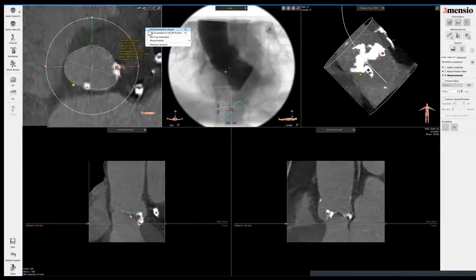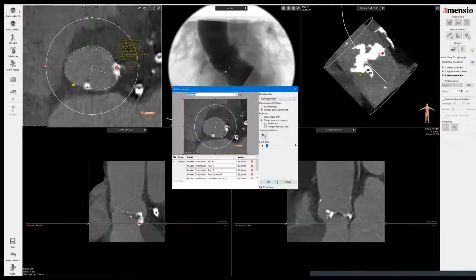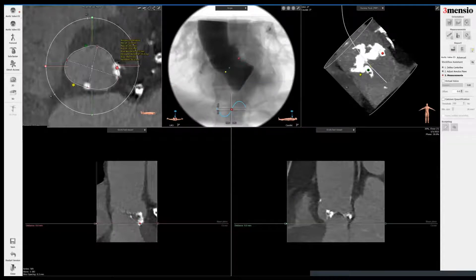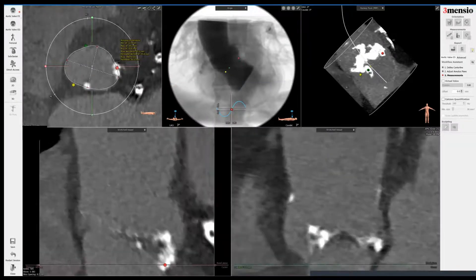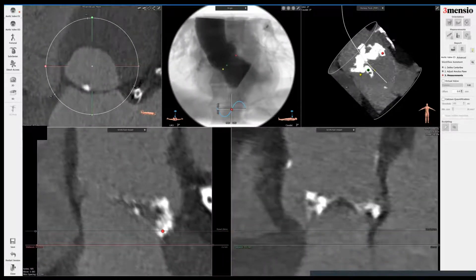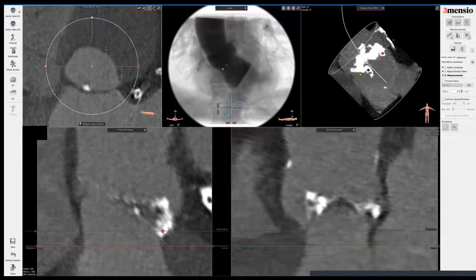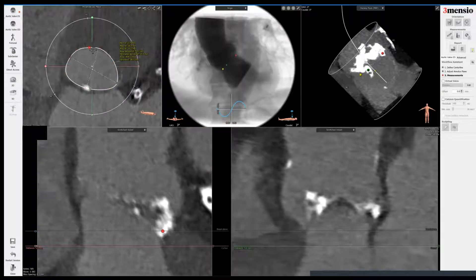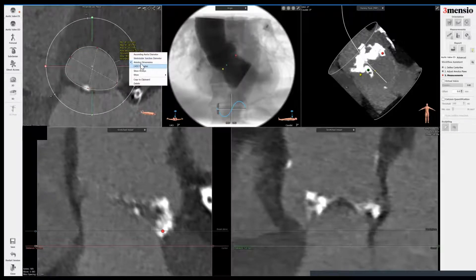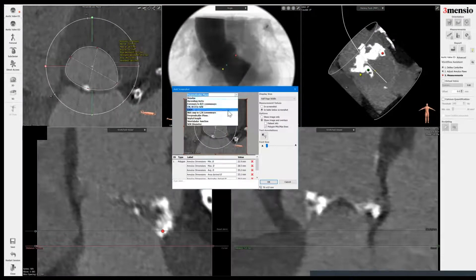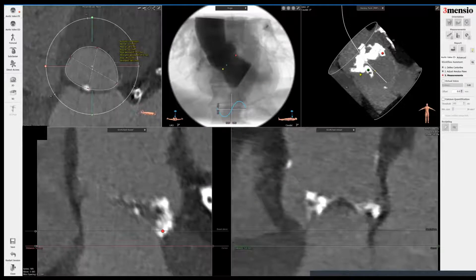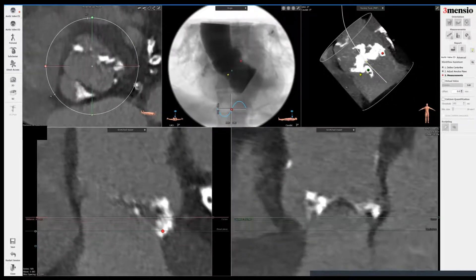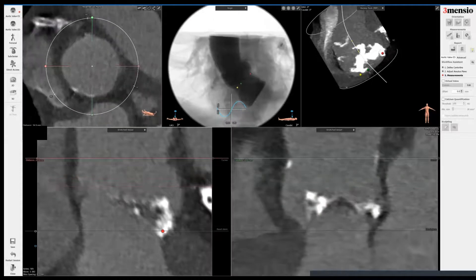Click on the annular dimension and save those images. I crop that, zoom to get a maximum view, and go into the LVOT view. You can see there's still LVOT calcium there. You can see how I cut across the annulus and adjusted the LVOT a little bit. I do it at a five millimeter depth — that's my personal preference because most transcatheter valves will end up at that depth on average. You can see this is the morphology of the bicuspid valve — this is Sievers type 1.